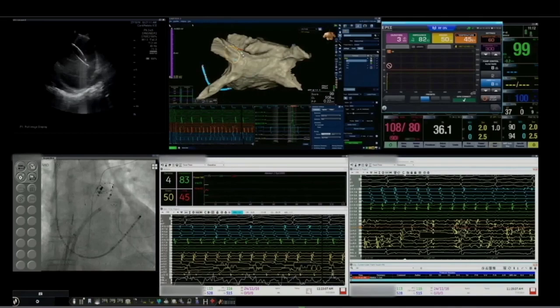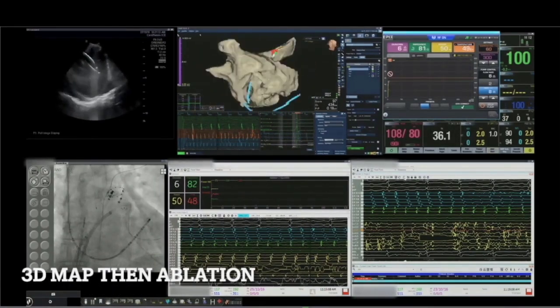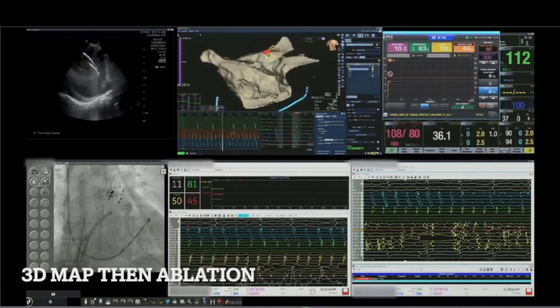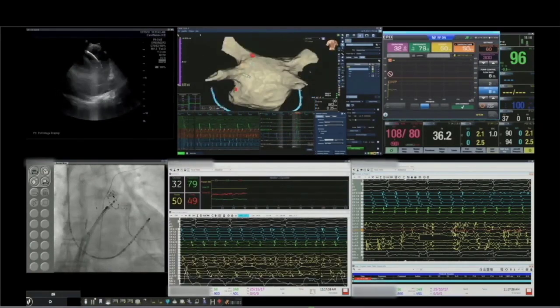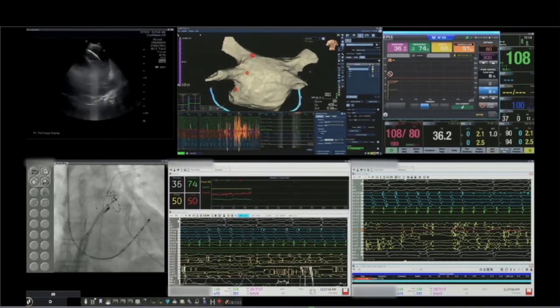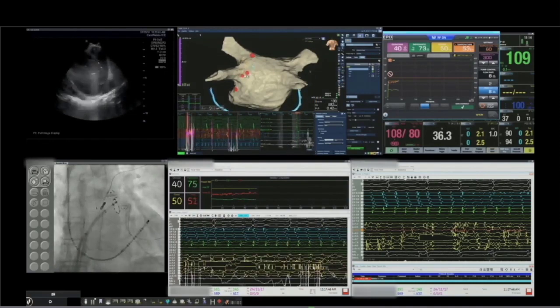And so just to tell everybody, we're going to start the video, but basically, I do use fluoroscopy. I know that there are folks that don't use it. I generally get about 5 to 15 minutes, depending upon the case. Now look, here we're ablating kind of anterior on the ridge. That was the initial spot. And it stayed on the ridge pretty well. So that's kind of the thing that I really liked about the catheter: you have pretty good control.